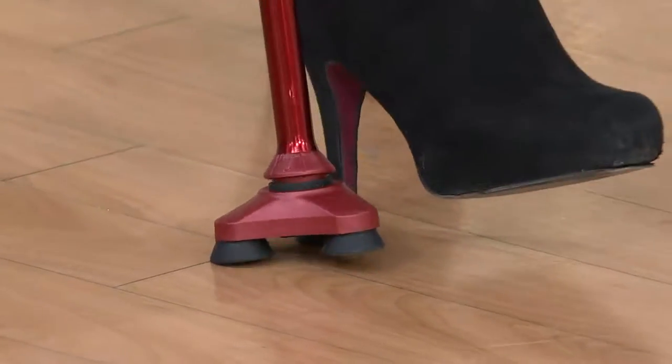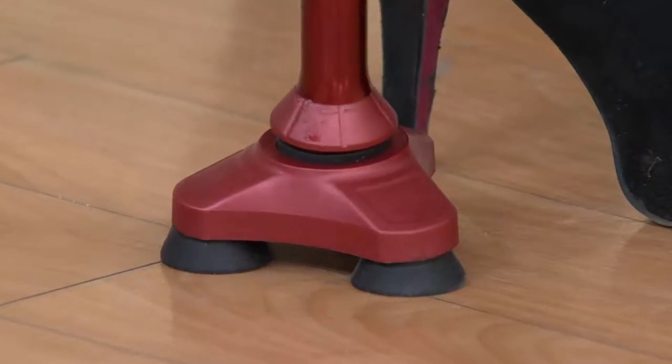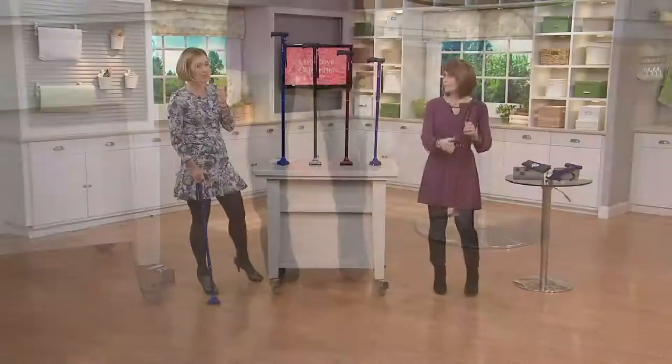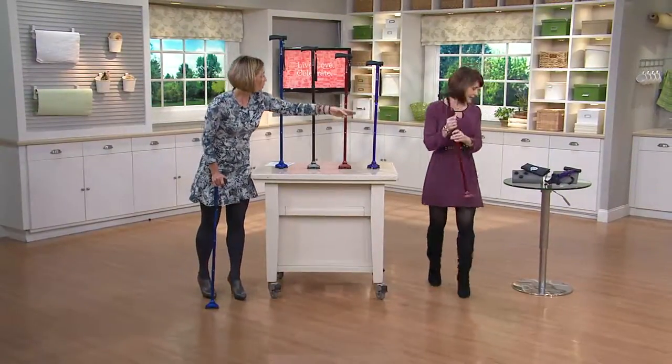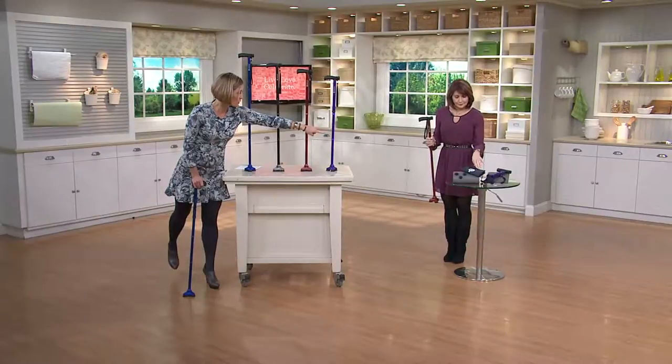There are a lot of great aspects to this cane as well. First of all, the price is crazy — featured price of $39.49. At retail, the HurryCane alone is $49. You're not only getting the HurryCane, you're also getting the bag and extra little feet.